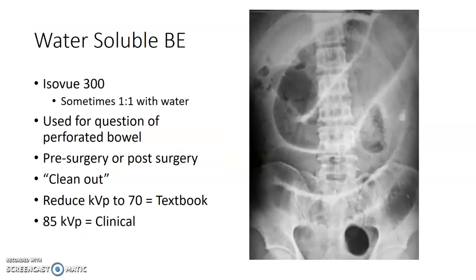Water-soluble BE, sorry, I always stumble over that word. We use Isovue 300, so that's water-soluble contrast. Sometimes the radiologist will ask for a one-to-one ratio with water. What does that mean? One container of contrast, you then fill that container with water. That's one container of Isovue, one to water, shake it like you mean it.